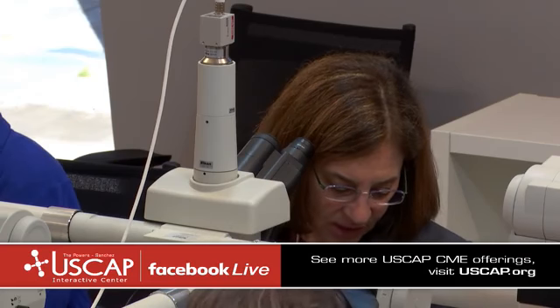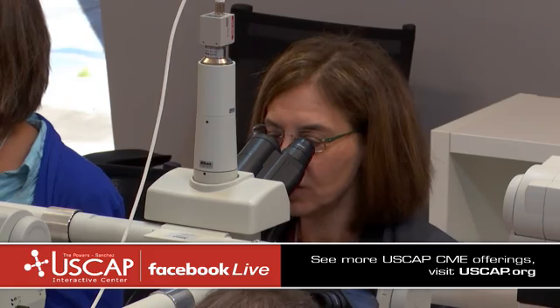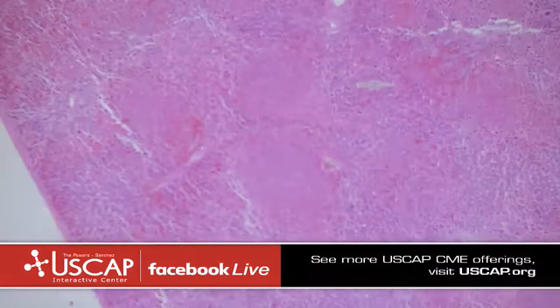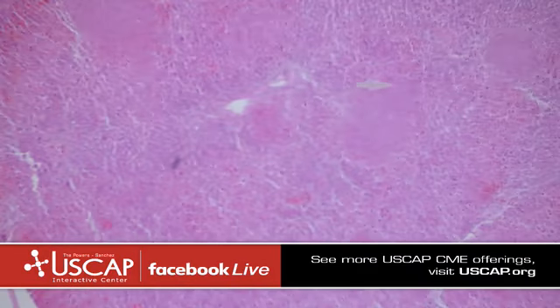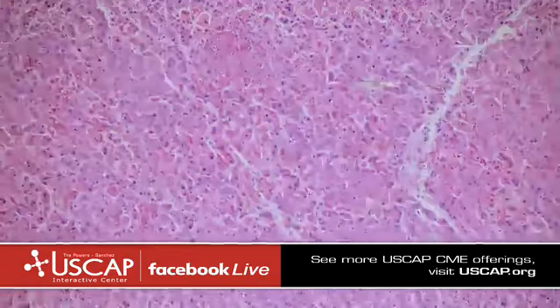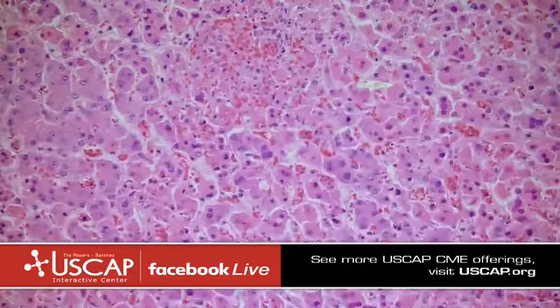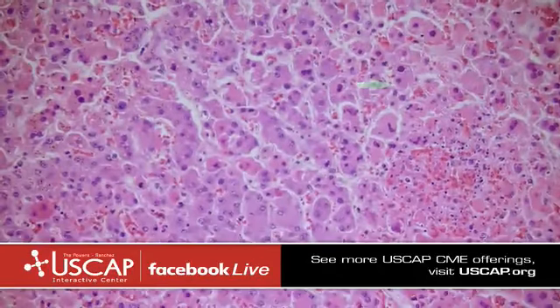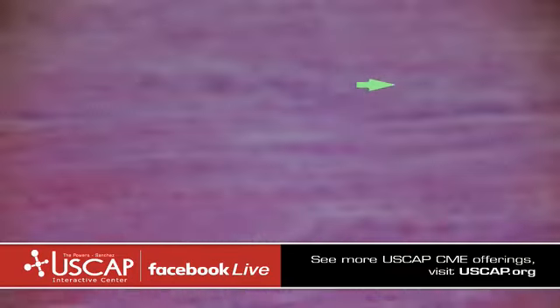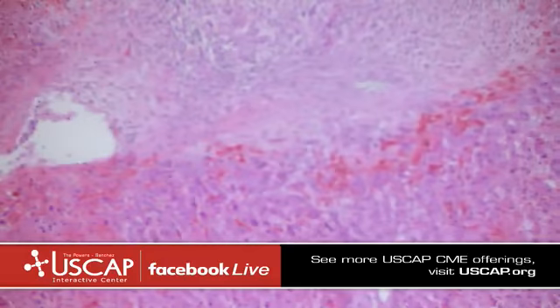Now, this is an HIV patient, and this is getting back to you could have more than one thing going on at once. And this has that necrosis pattern, no question. So everyone's thinking herpes, because it's an immunocompromised patient with these nice herpes inclusions. These are a little better for herpes that everyone's a little more used to with multinucleation. A little better. But you keep looking, right? Because livers can have more than one thing, particularly in immunocompromised patients, and this patient had this too.